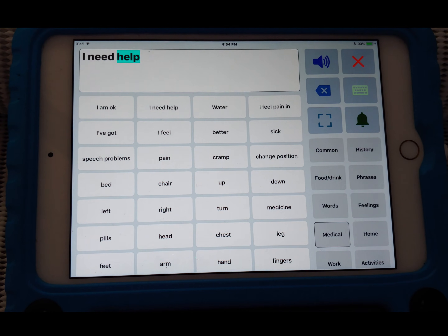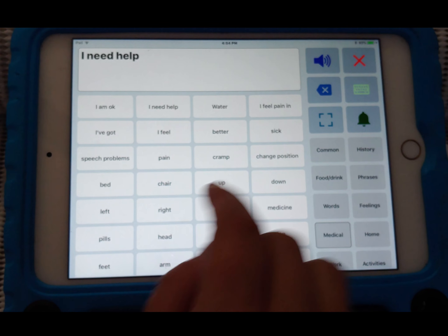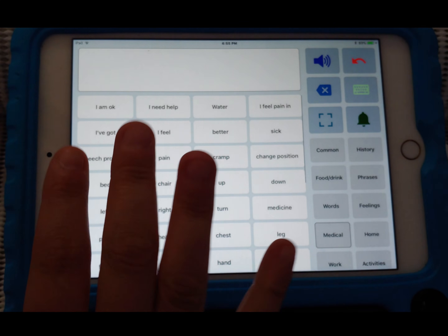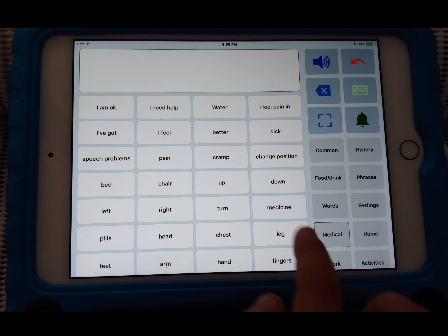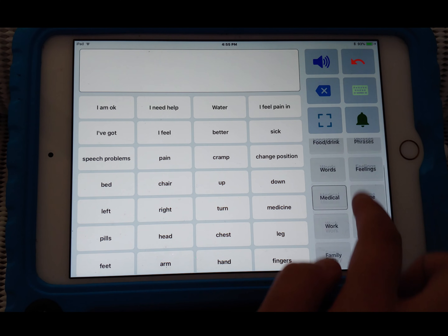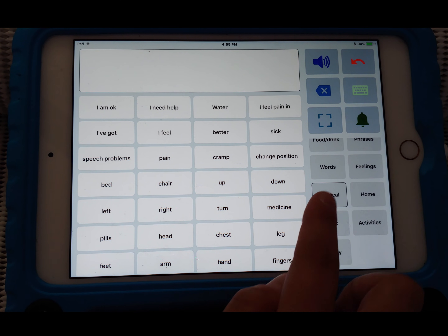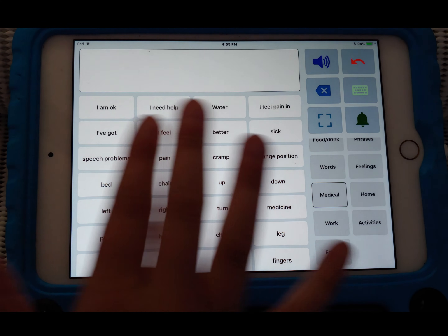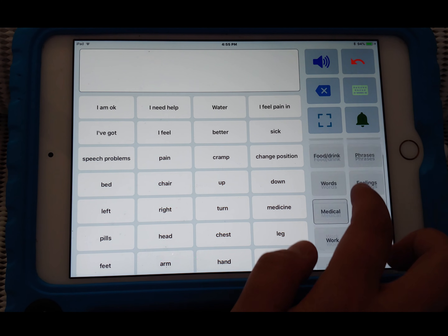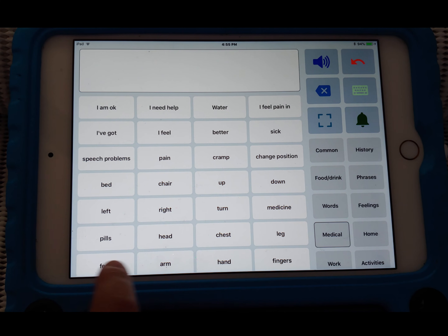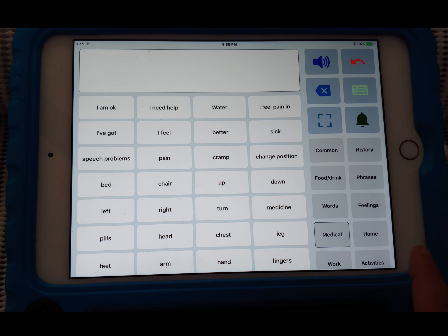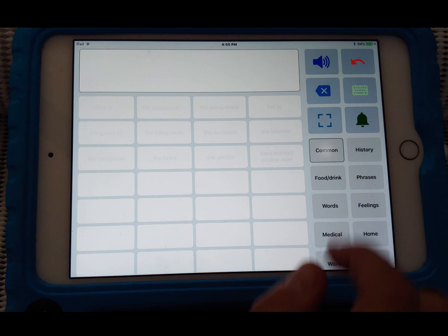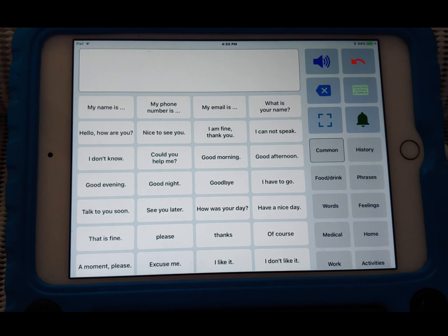If you press a quick access phrase, it just says it automatically and then you can clear it out. To organize your phrases and find them more easily, you have the bottom right section — these are called categories. I'm in the medical category, so you'll see pain, changed positioning, and other medical topics. You can edit all of this too. For example, the home category has home-related phrases. There's also a history of things you've said.